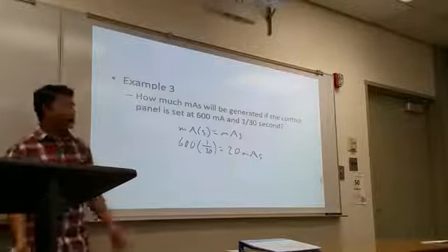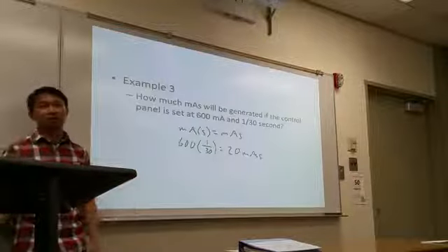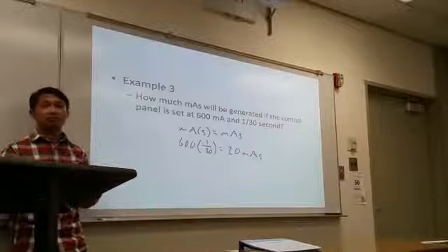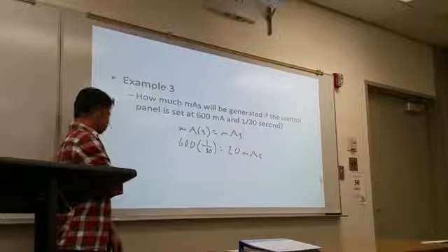Okay, so on the quiz or test, you can have any of those combinations of time selection. It could be in milliseconds, it could be in decimal, or it could be in fraction. Watch your units.